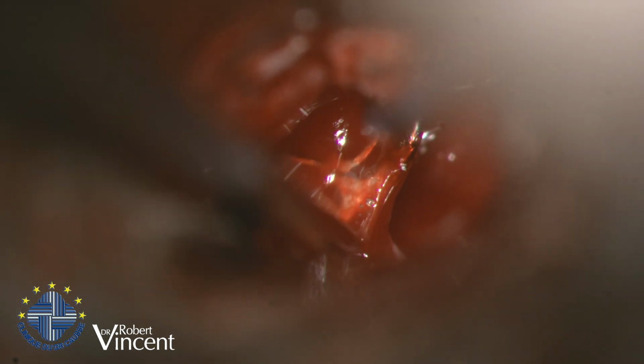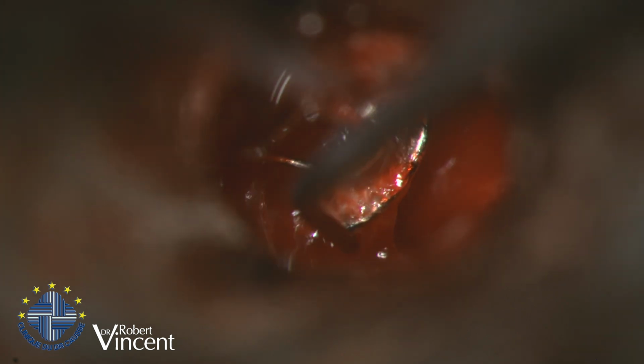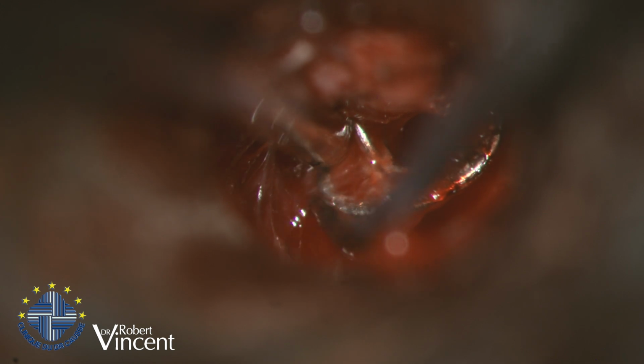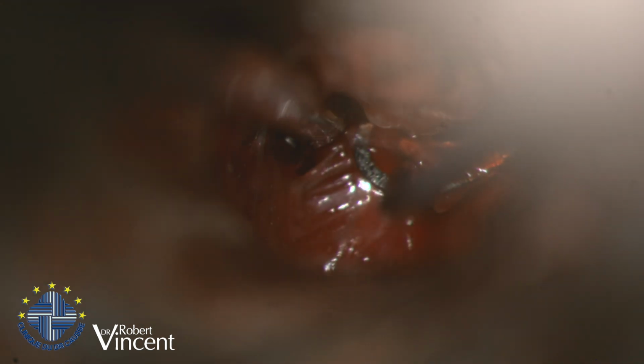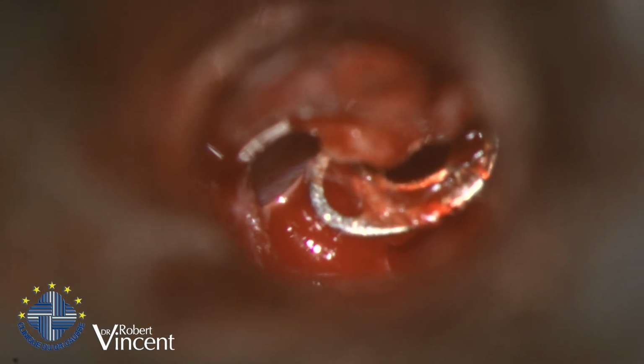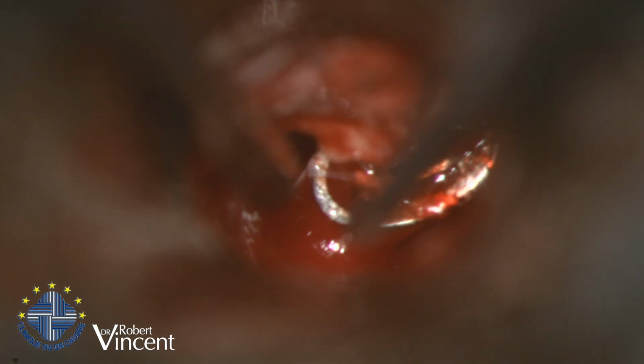This looks strange for me. I didn't see any shaft at the moment. There is a shaft, for sure. But the problem, I cannot remove it unless I can identify the connection with the facial nerve. This is the reason why I don't like titanium too much. When you revise, it's always a problem. Okay, the facial nerve is below that, so this is only fibrous tissue.